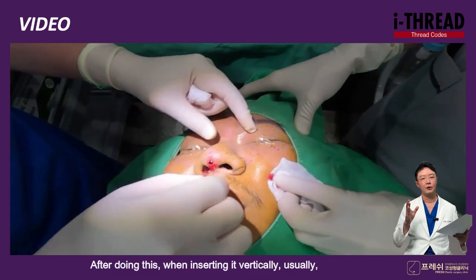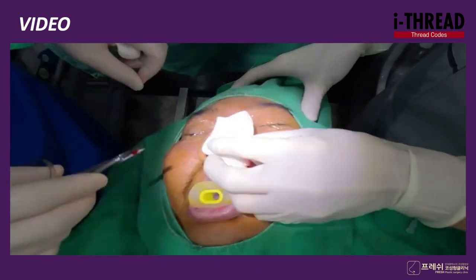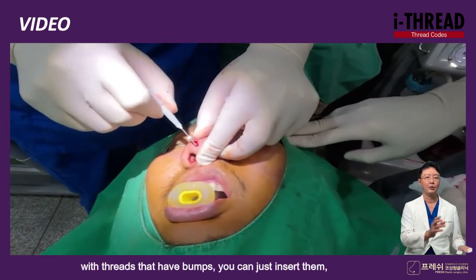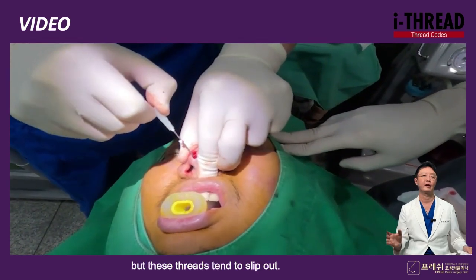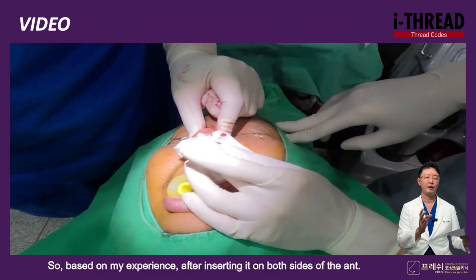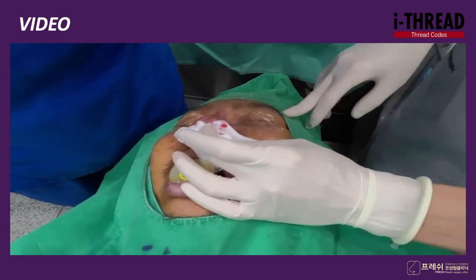After doing this, when inserting it vertically, usually, there's a point called the anterior nasal spine. Inserting it around the anterior nasal spine, with threads that have bumps, you can just insert them. But these threads tend to slip out. So, based on my experience, after inserting it on both sides of the anterior nasal spine, you need to press here firmly and then remove it so that the thread doesn't slip out.